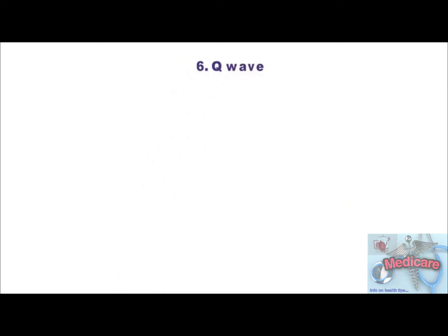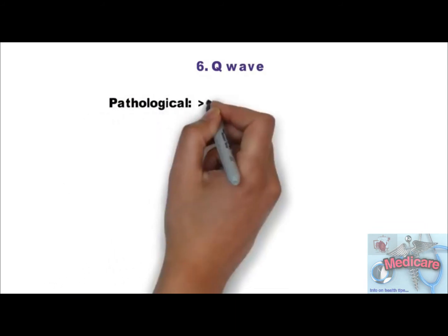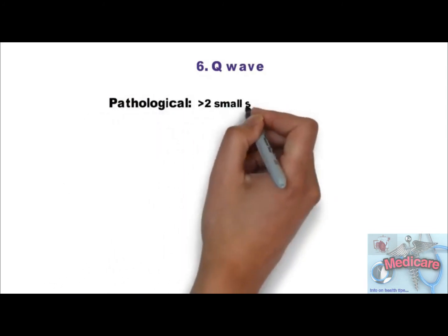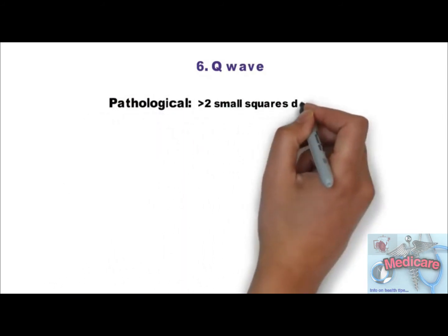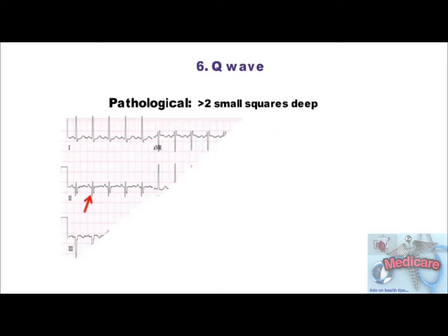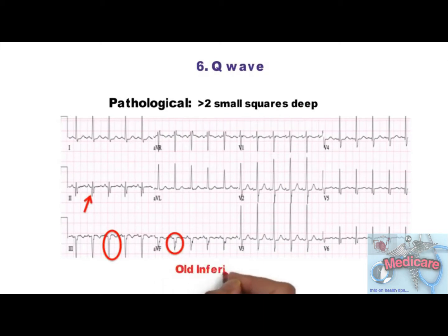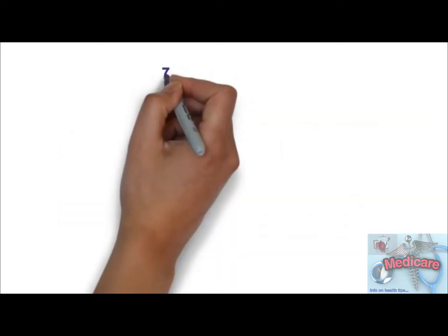Step 6 is Q wave. It is called pathological if more than 2 small squares deep, and usually indicates current or past MI. As you can see, deep Q waves in inferior leads 2, 3, and AVF — so this is the ECG of an old inferior wall MI.